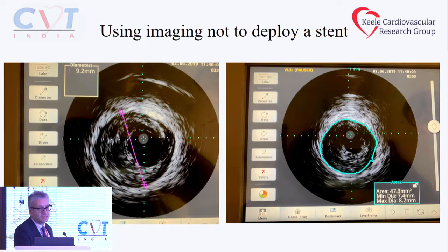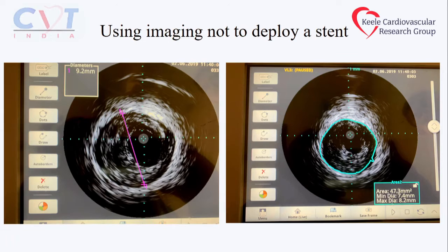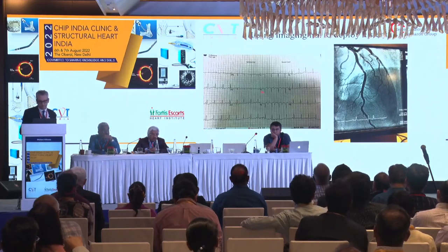And so the way I treated this was not by stenting it, just ballooning to get TIMI-3 flow, give a NOAC for a week to dissolve the thrombus, and then medical management, and the patient did well. If I'd have stented this, I'd have probably put in a grossly undersized stent and had the risk of stent thrombosis potentially. Here's another case.